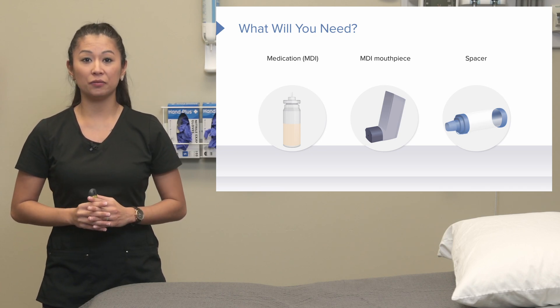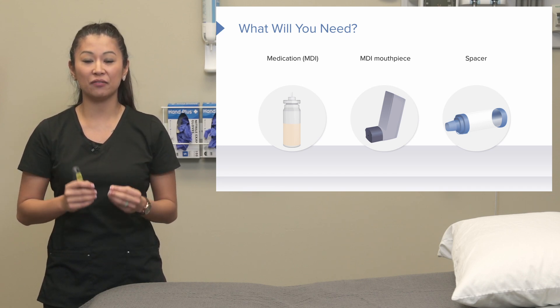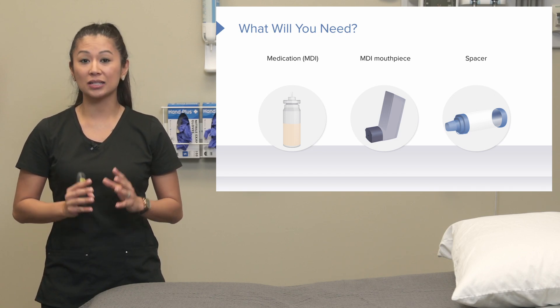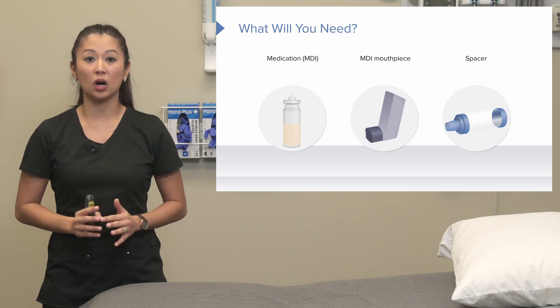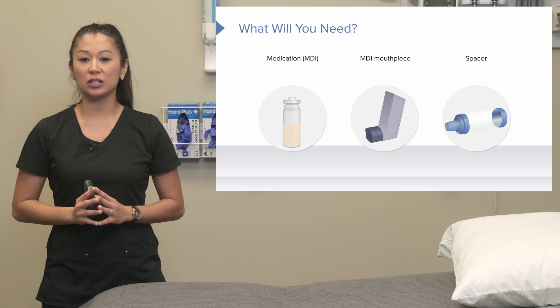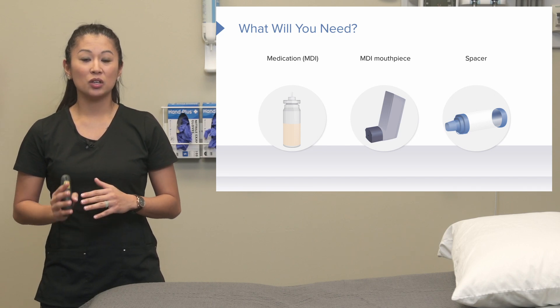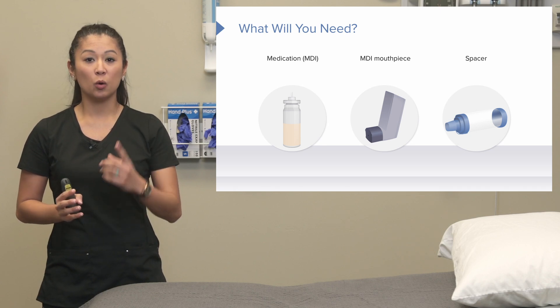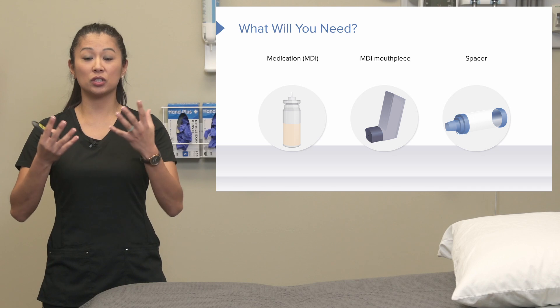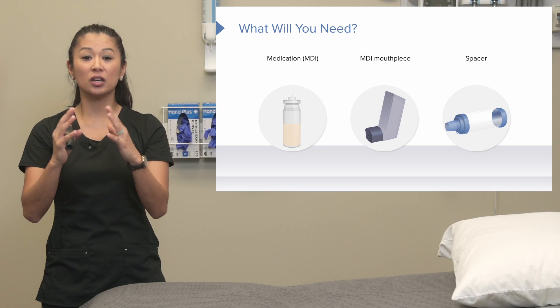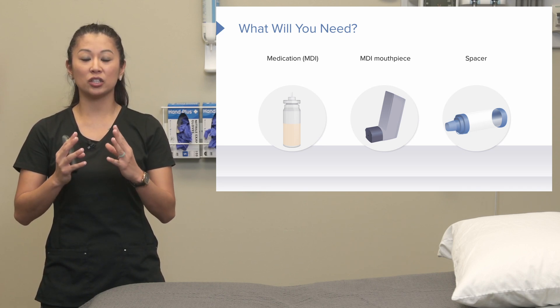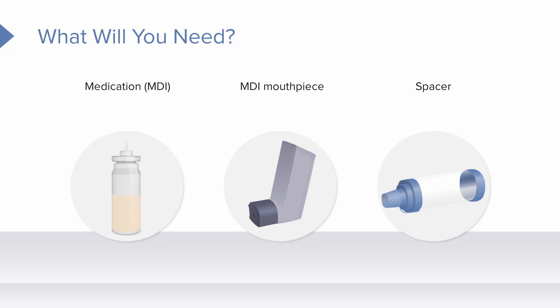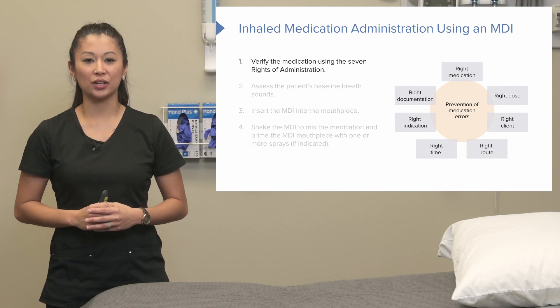Let's look at the equipment. First, you need the medication itself, which usually slides into a specific mouthpiece. Some inhalers — not all — have something called a spacer. A spacer is an extra piece of equipment that attaches to the mouthpiece. When the medication squirts into the spacer, it aerosolizes and gets trapped in the clear portion so it doesn't escape into the air. This gives the patient a little more time to breathe the medication into their lungs for maximum effect.